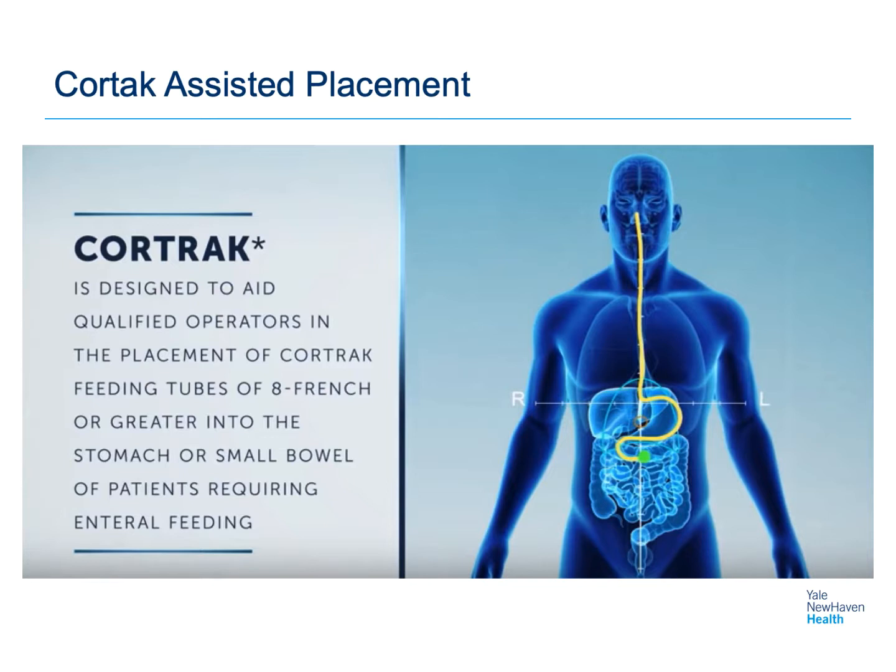The tube goes in through the nose. It goes down vertically through the esophagus into the stomach, along the greater curvature of the stomach, and then this tube is placed into the beginning of the small intestine. So I'm going to talk to you a little bit more about how this machine works and how to set it up so you have that information when you have to place these tubes at the bedside.